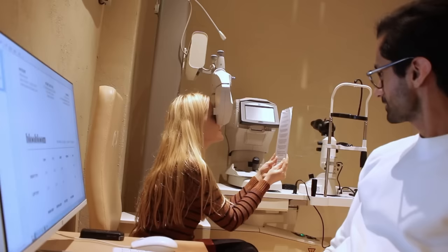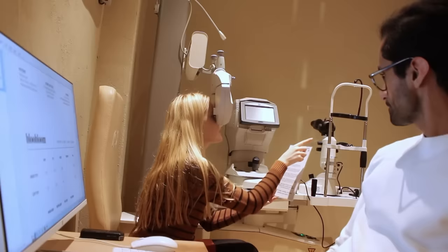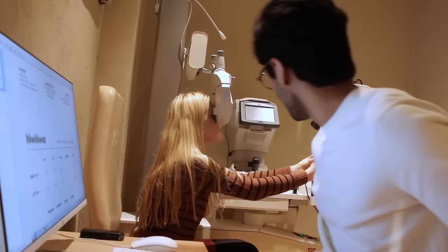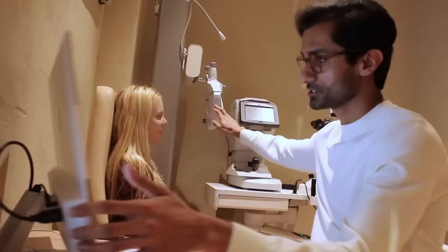And then when you use a screen, is it a desktop, laptop? What kind of monitor is it? I usually have a proper monitor about this, a bit further away from me. If you stretch your arm as far as you can then. I'd maybe try and read about N10 or N8 for a screen. Okay, yeah, you can do that. N8, yeah. Okay, awesome. You can sit back. That's good. Let me show you here, your prescription.